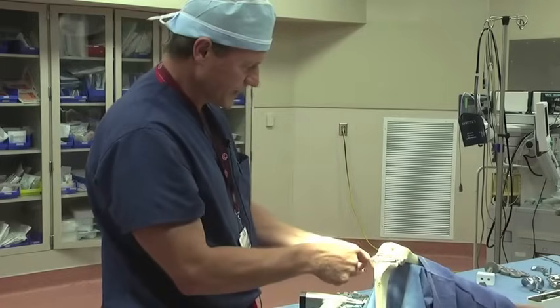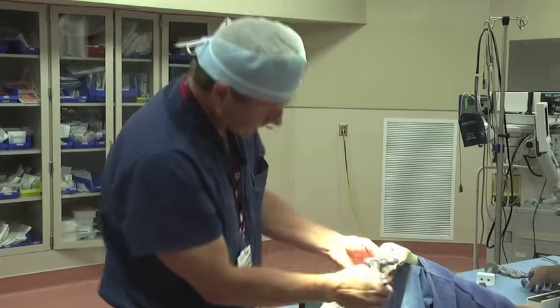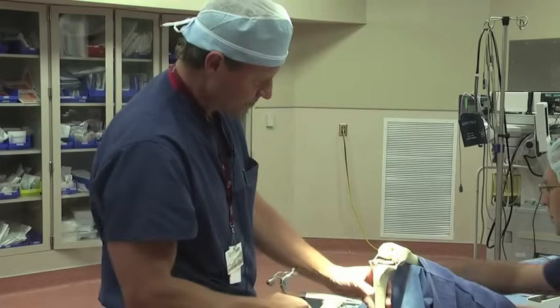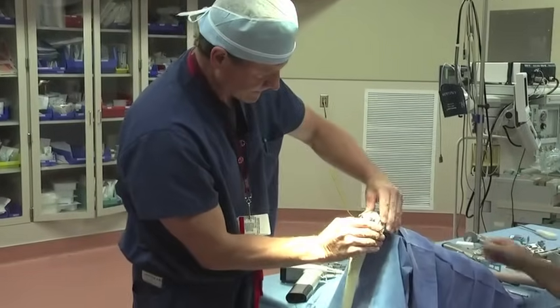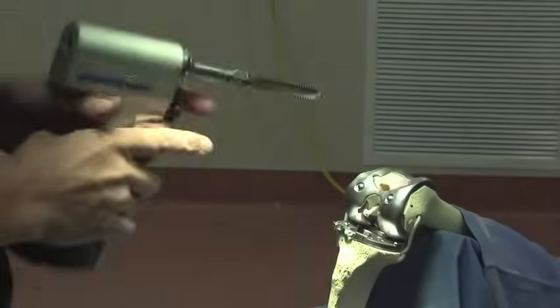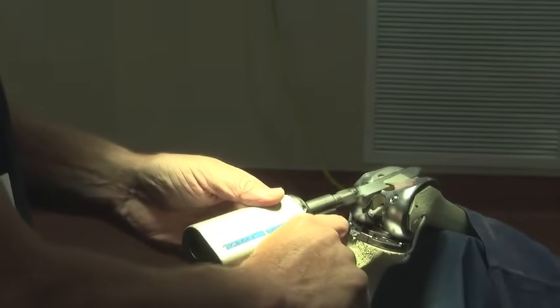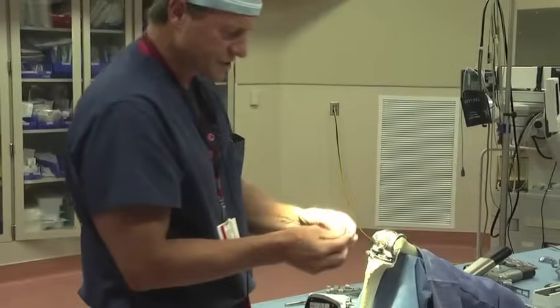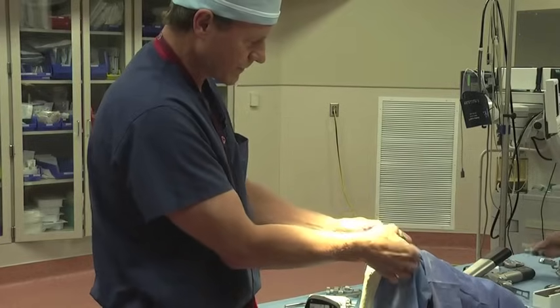Once we've prepared the tibia, we'll remove this handle. We'll go back and turn our attention to the femur, put the femur into place. Next, to finish the groove for where the patella will ride in the implant, we'll make a little cut along here. To finish this so we can trial it, we'll put this plastic piece on for the trial.